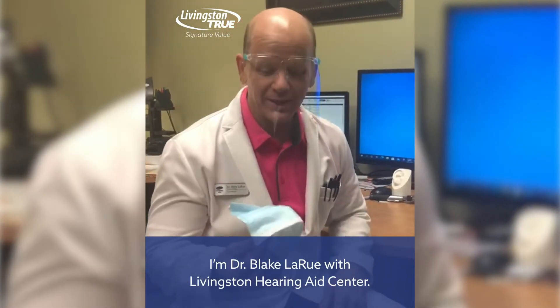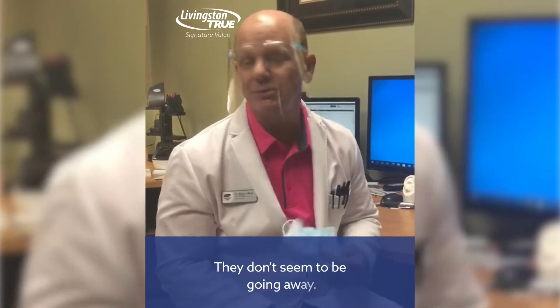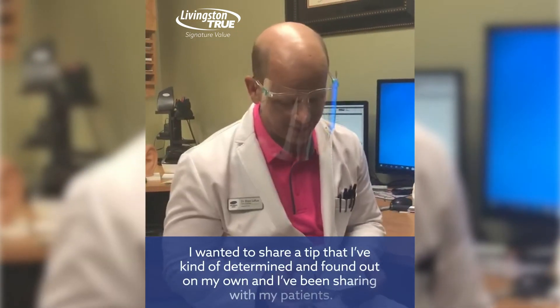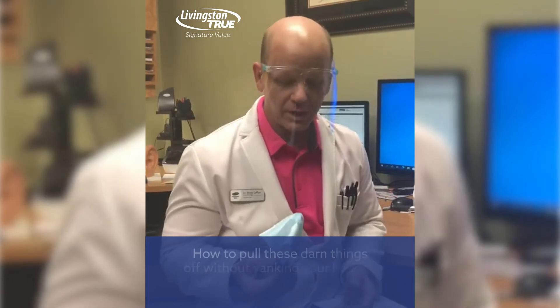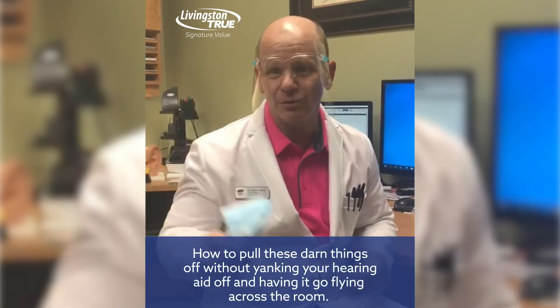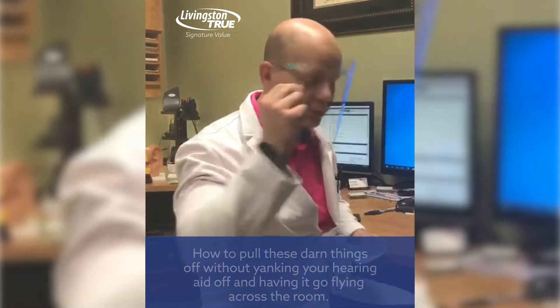Hi everyone, I'm Dr. Blake LaRue with Livingston Hearing Aid Center. Masks seem to be in the forefront — they don't seem to be going away. I wanted to share a tip that I've determined and found out on my own and have been sharing with my patients: how to pull these darn things off without yanking your hearing aid off and having it go flying across the room.